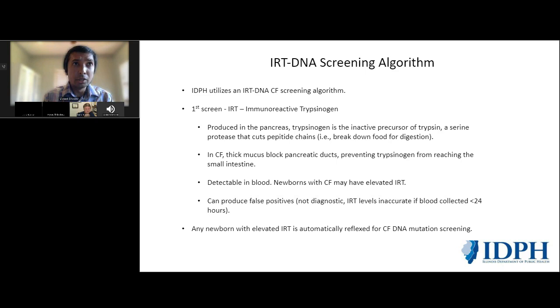So whenever we see this in the laboratory, any baby whose blood was collected below 24 hours, we typically rule that as unsatisfactory for IRT screening for cystic fibrosis, because the IRT levels just aren't reliable.